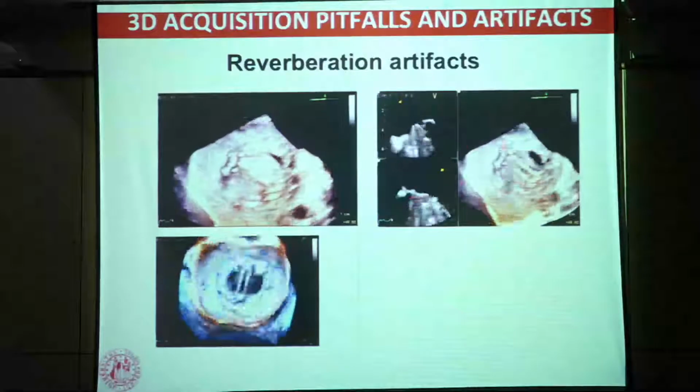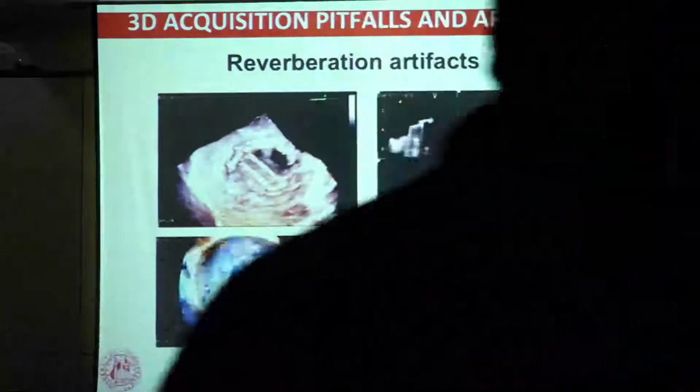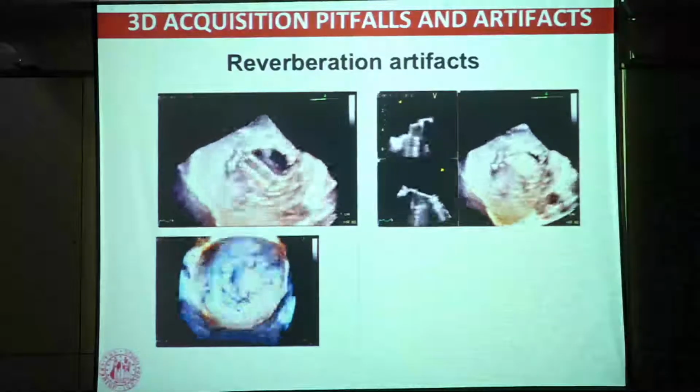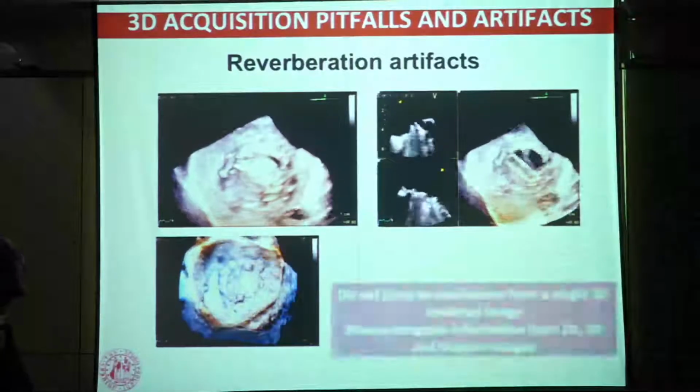Pay attention to this one, particularly when you have a prosthesis or similar structures, otherwise you can make really big mistakes in the diagnosis.